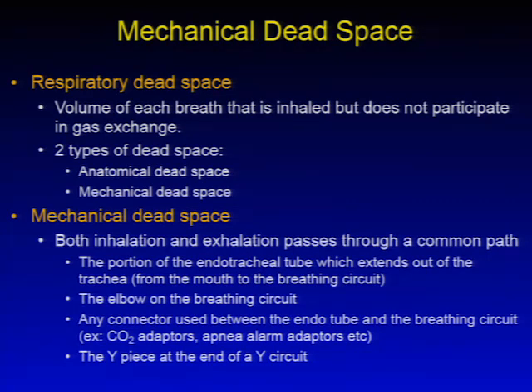So, mechanical dead space. In general, respiratory dead space is defined as the volume of each breath that is inhaled but does not participate in the gas exchange. There are two kinds of dead spaces. One is the anatomical dead space, and the other is the mechanical dead space. The mechanical dead space is important, and it is defined as where both inhalation and exhalation pass through a common pathway.